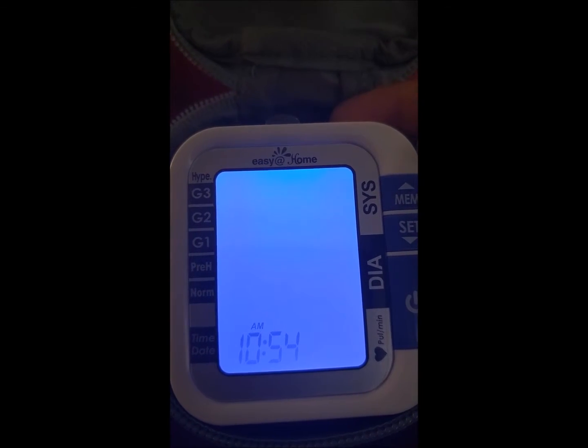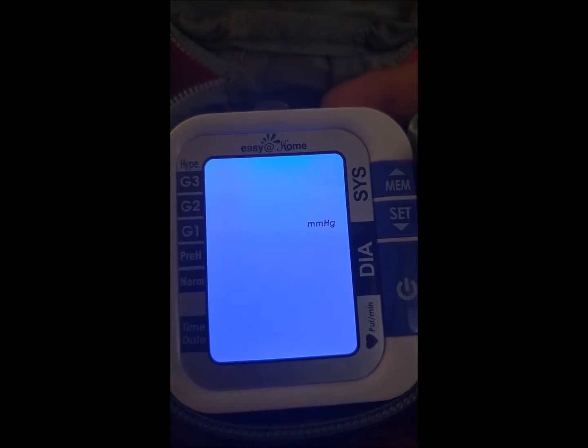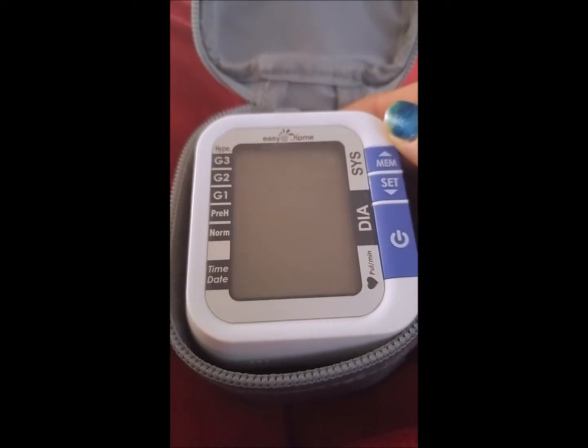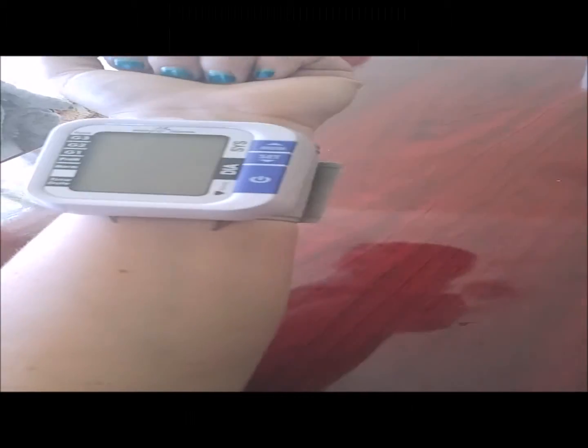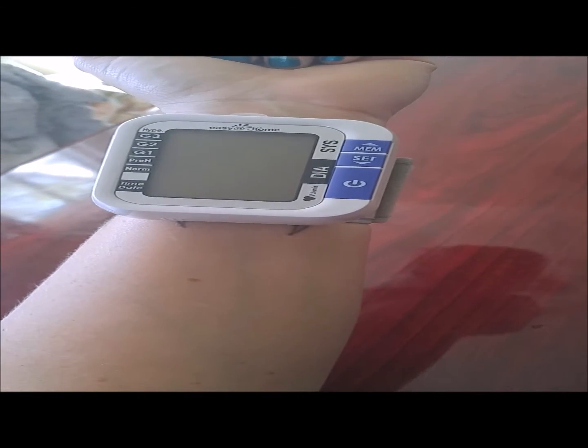Now our day and time is set. You'll have an option to change your measurement unit, and we're going to keep that as our measurement unit. Once it's set, your settings will flash in front of you — everything that you set — so you can make sure it's all correct. Then your unit will shut itself off. Now the unit is ready to use.